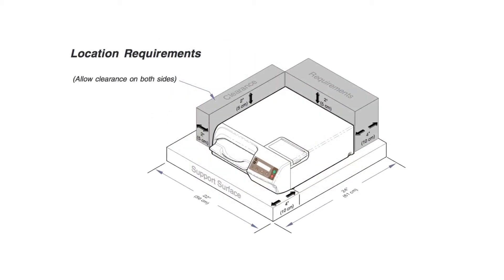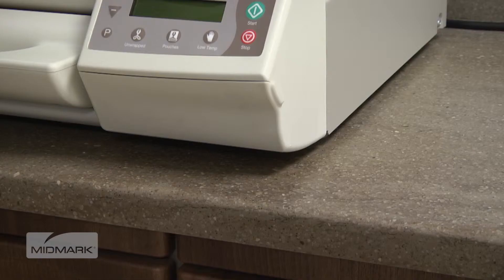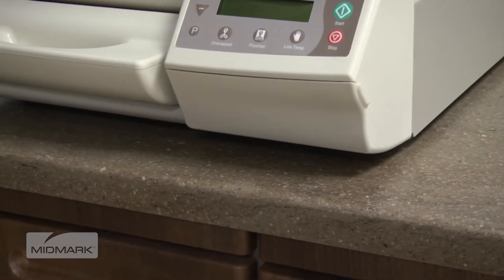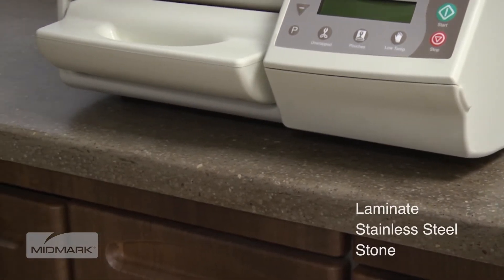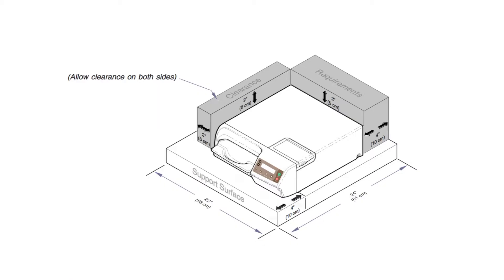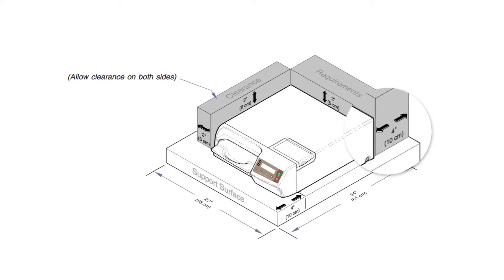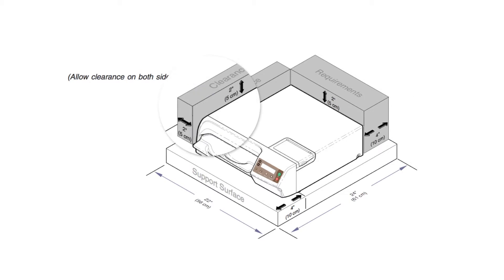This illustration can be found in the M3 User's Guide. It provides critical information for installing the M3 Ultrafast, including required clearances around the unit. These recommendations must be followed to ensure optimum performance of your autoclave. Support surface materials should be water-resistant, for example, laminate, stainless steel, or stone. The surface must be level to ensure proper operation. Allow a 4-inch clearance from the front feet to the front of the support surface, 4 inches from the back of the unit to the back wall, and 2 inches on either side.